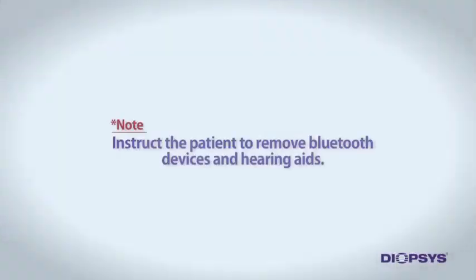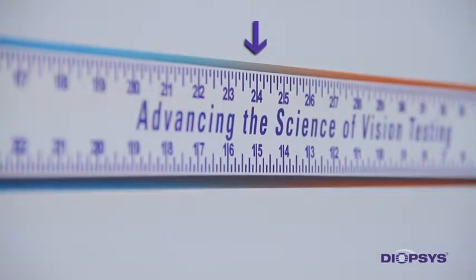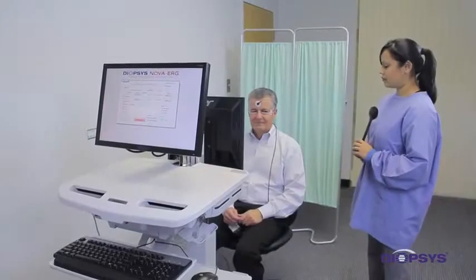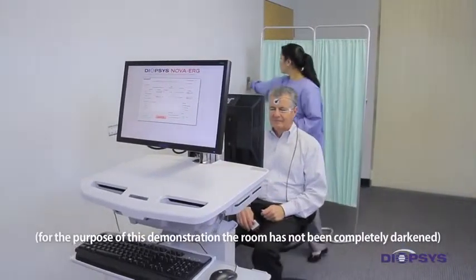Adjust the lead wires so they rest gently and comfortably over the patient's ear and out of their line of sight. Instruct the patient to remove Bluetooth devices or external hearing aids if necessary. Next, make sure the patient is properly refracted for 24 inches and is placed 24 inches from the patient-facing screen. You may use best corrected distance vision and add a trial lens of plus 1.50. The patient should not be wearing bifocals or progressive lenses, as this can cause inaccurate recordings. Once the patient is prepped and positioned correctly, completely darken the room and begin the test.